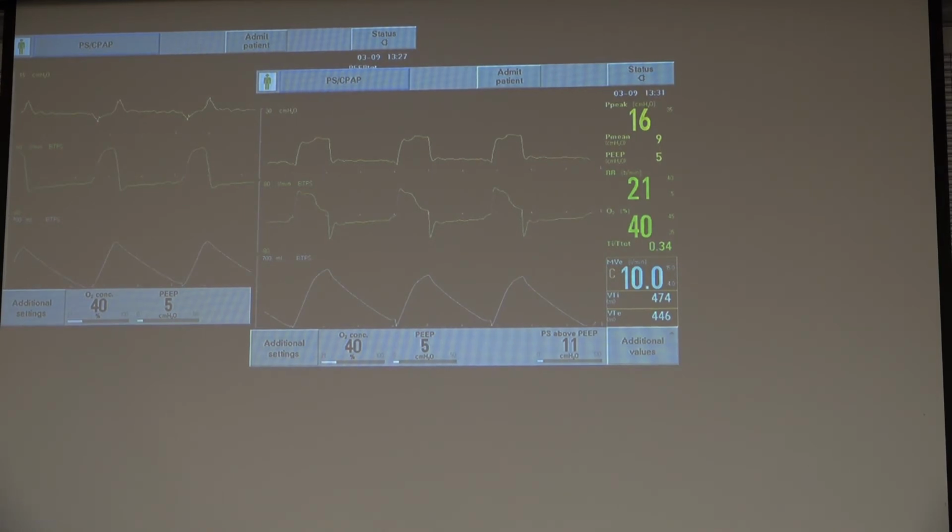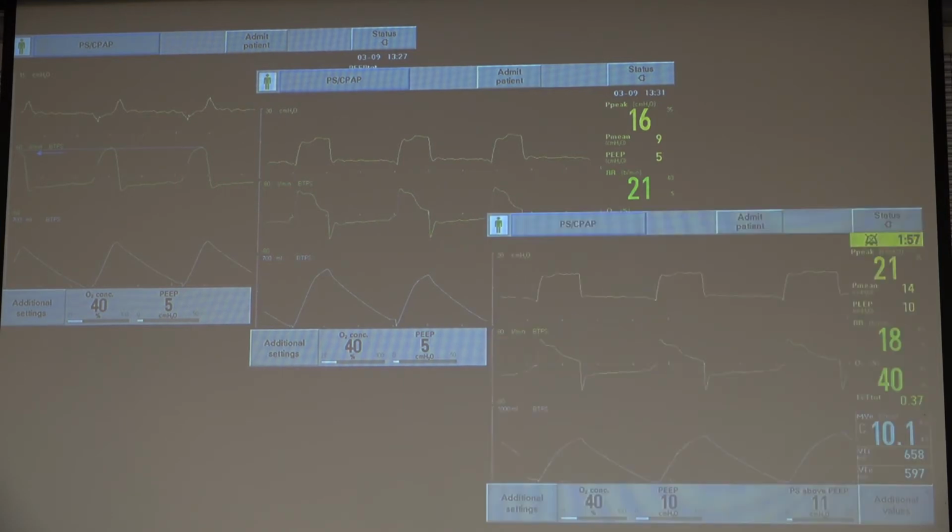And finally, recognizing this is a patient with COPD. Sorry, some waveforms there again. Our pressure is higher than what we had. Adding a little more PEEP to this patient can take away some of the ineffective triggering that we have, and therefore decrease respiratory rate for that effort for that patient, resulting in a much more appropriate pressure support waveform without a lot of patient effort, better patient synchrony.